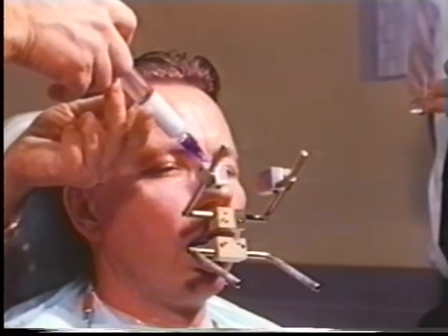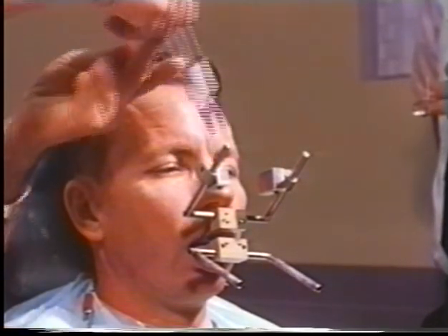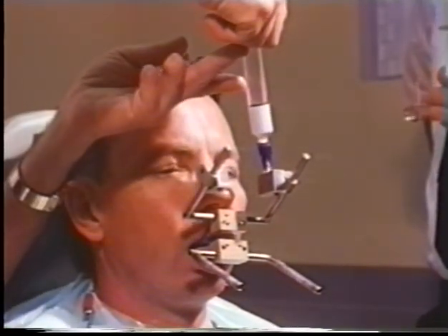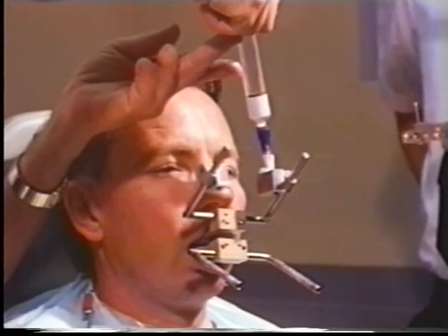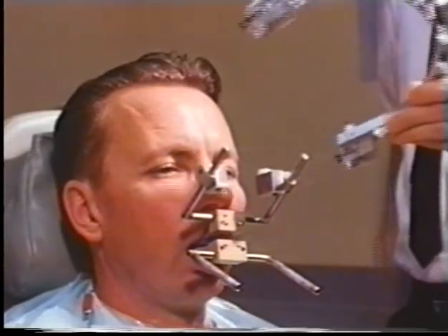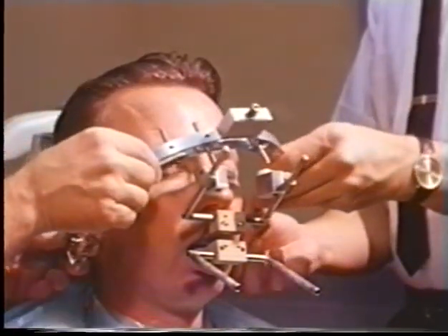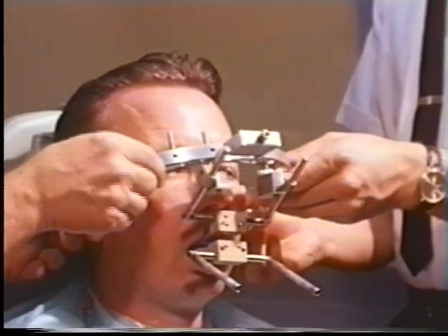The two cups on the upper frame are filled with quick-setting plaster in preparation for attaching the upper bow to the maxilla. This is accomplished by inserting the ends of two vertical rods of the bow into the soft plaster.